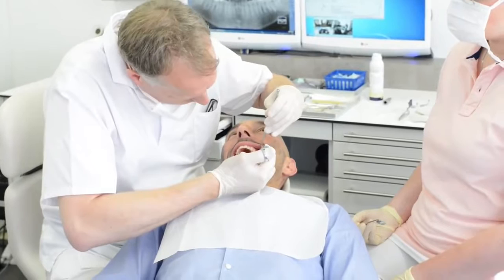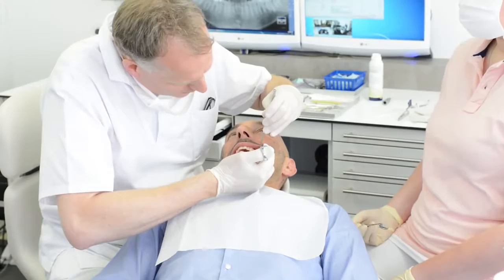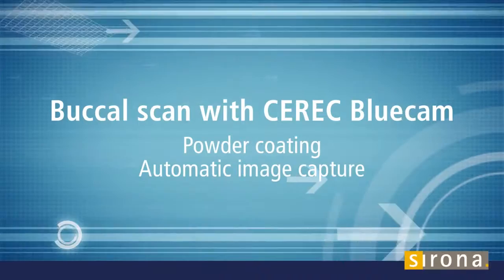While waiting for the injection to take effect and before the patient feels any numbness, we proceed with the Buccal Scan, highlighting the differences in basic use between the two cameras.